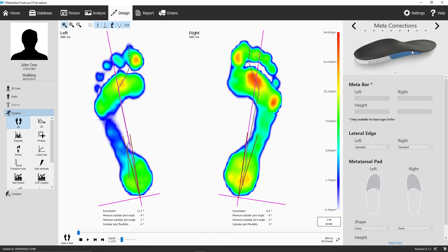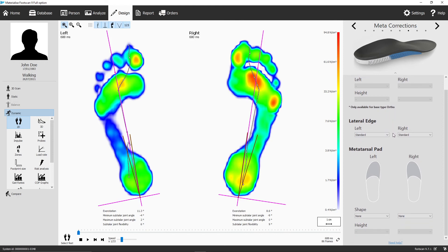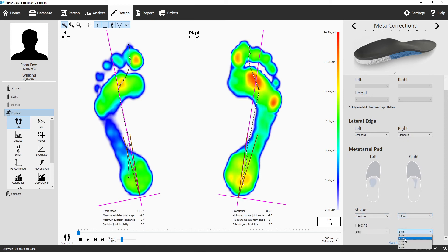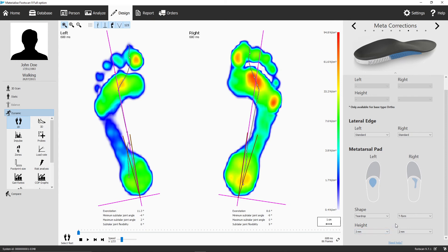The meta-corrections panel has 3 different types of metatarsal supports, and allows you to lower the lateral edge if necessary. The meta-bar is only available for the ortho or the ortho slim type, where the metatarsal pads, the teardrop, and the T-form are always available. However, go easy with the height of these pads, as one or two millimeters will already be significant support for your patient.